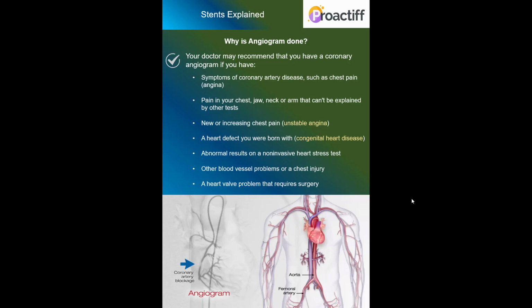Since the use case scenarios are different, based on each of the specific cases and the related contributing factors, the doctor would make the appropriate recommendations as to which angiogram has to be performed and for what purposes, and what it's going to take. It's a relatively straightforward procedure these days with the technology advancing, and millions of people have availed of this procedure over time.